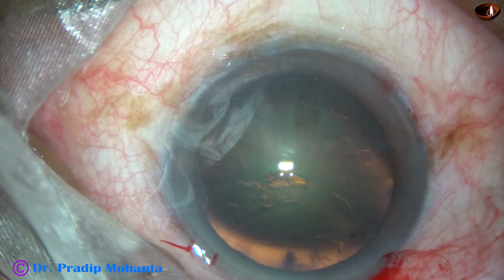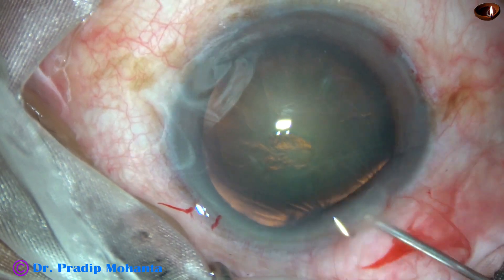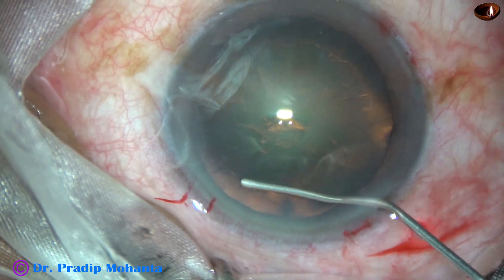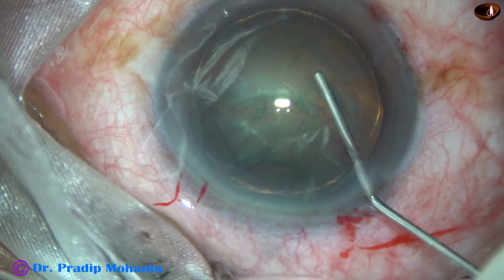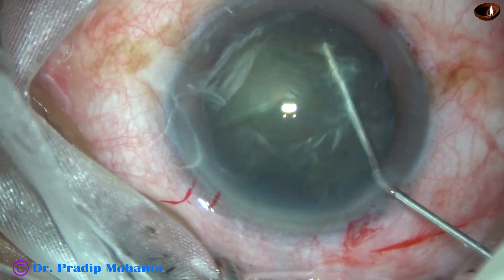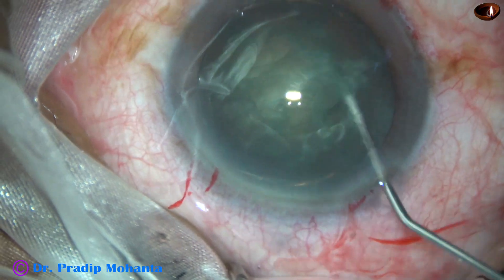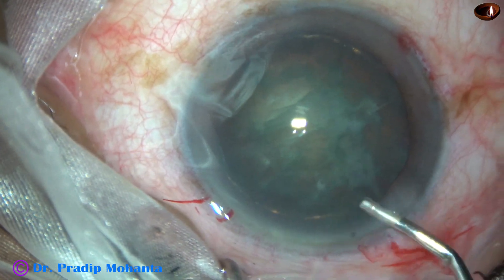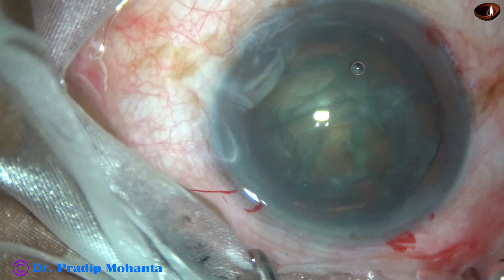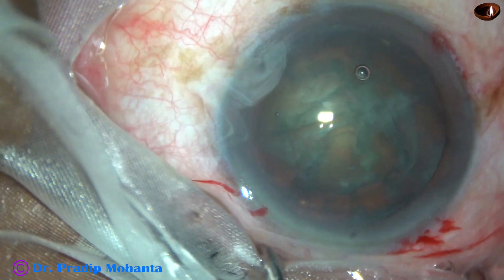The rhexis is complete. Now, hydrodissection. BSS is passed just under the anterior capsular rim with a 27-gauge cannula. The fluid wave goes to the other side. Hydro delineation is also done. And now, the nucleus is rotated very nicely, clockwise as well as anticlockwise. Some more viscoelastic is applied in the anterior chamber.